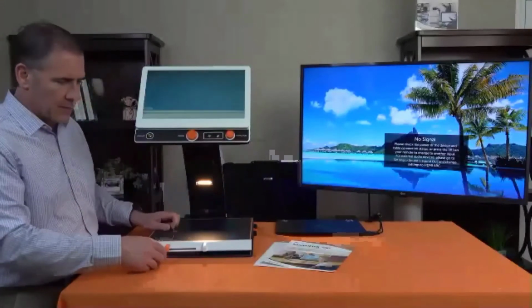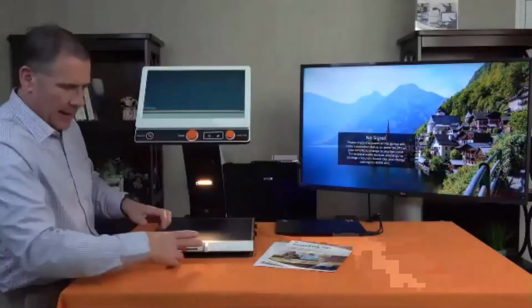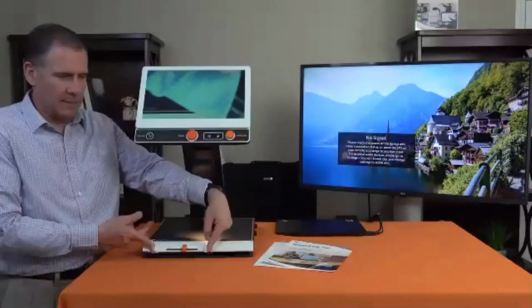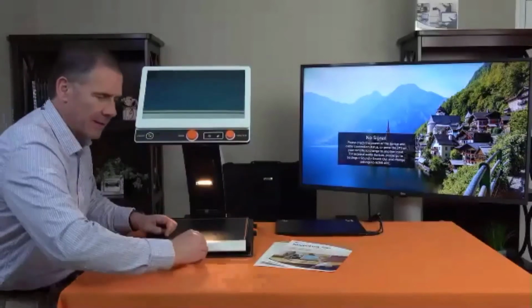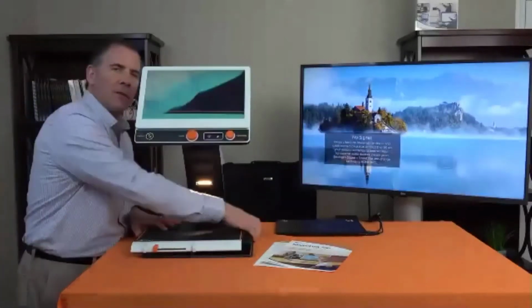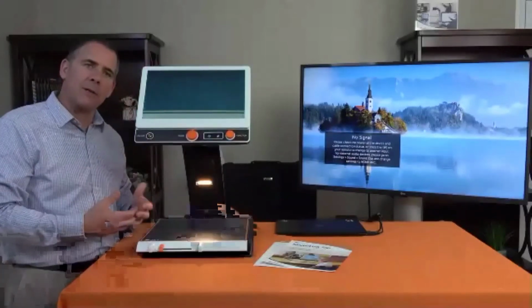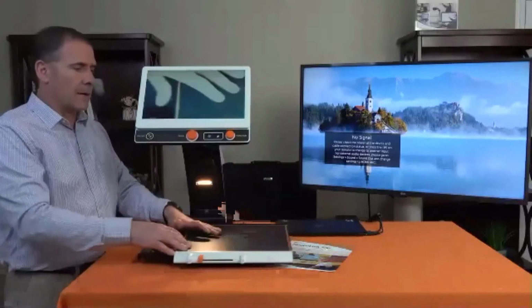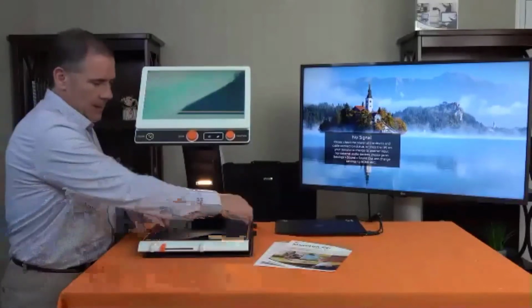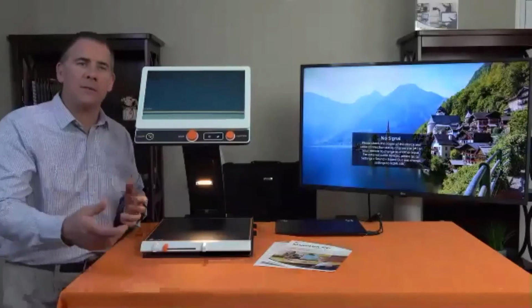And another cool thing are the brakes. Like, I'm not holding this to move the brake. I have notches, something to grab onto to adjust my brake from each side. Same with this brake back here. So I can friction it. I can apply some friction to the XY table, or I can lock it. I can lock it out here, over here. I can lock it right under it by sliding these orange, bright, nice orange levers into position.